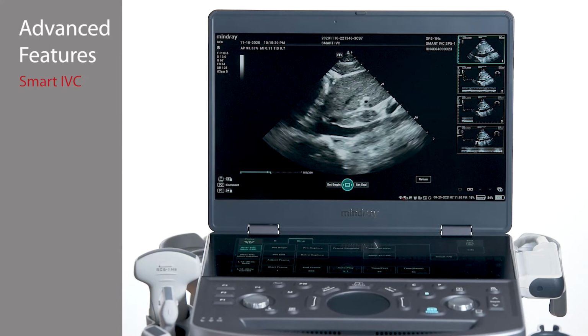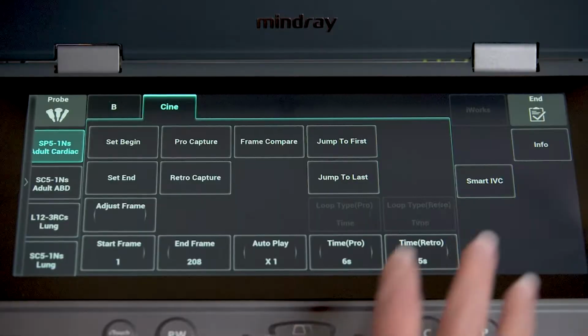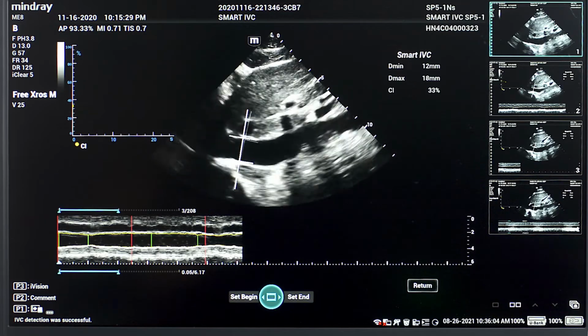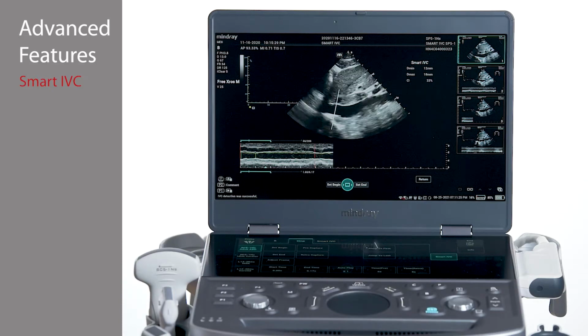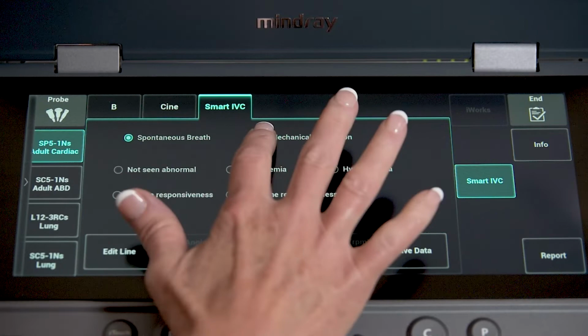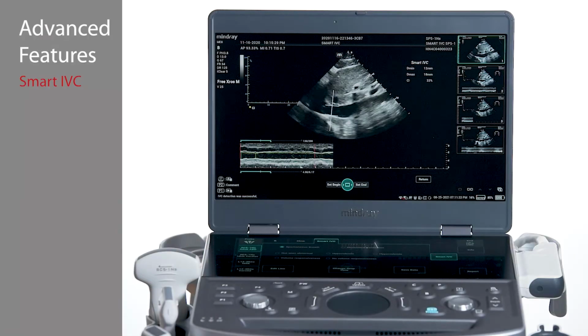To calculate during real-time imaging, scan the IVC in long axis and press the Smart IVC tab on the touch panel. The system will automatically locate the IVC target area, track, and measure the change in IVC diameter. Select Spontaneous Breath or Mechanical Ventilation, which is located on the touch panel under the Smart IVC tab.